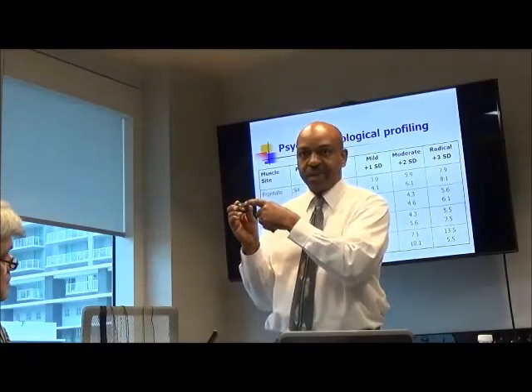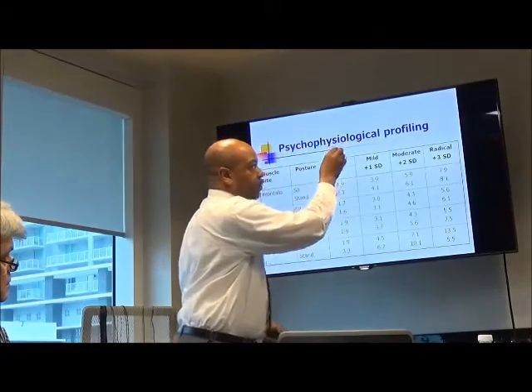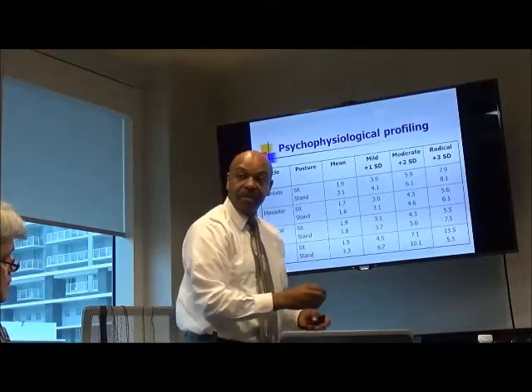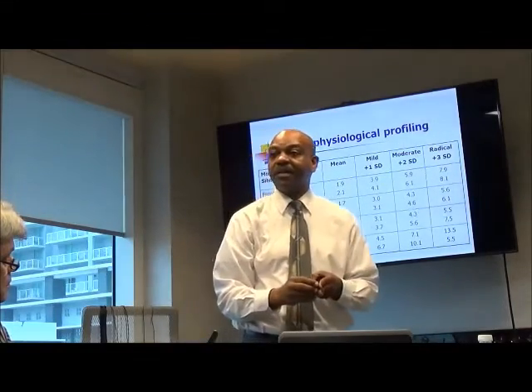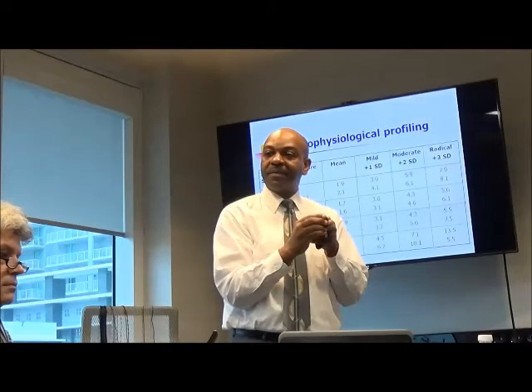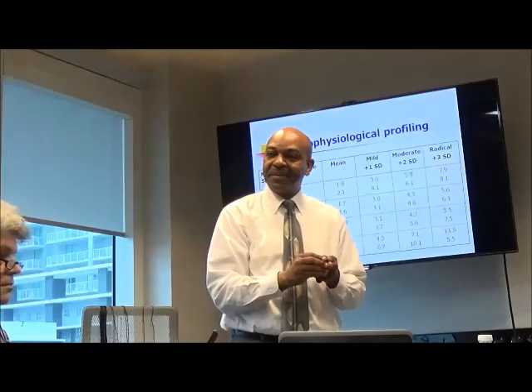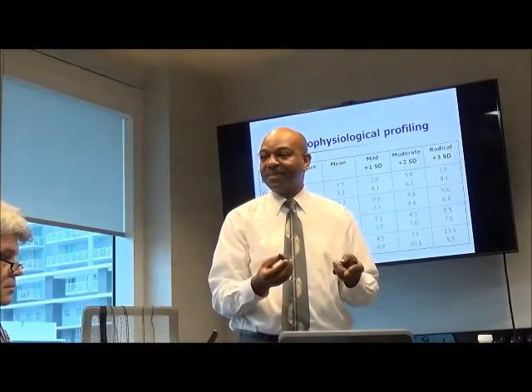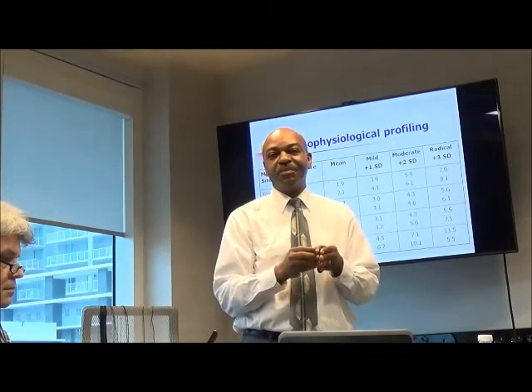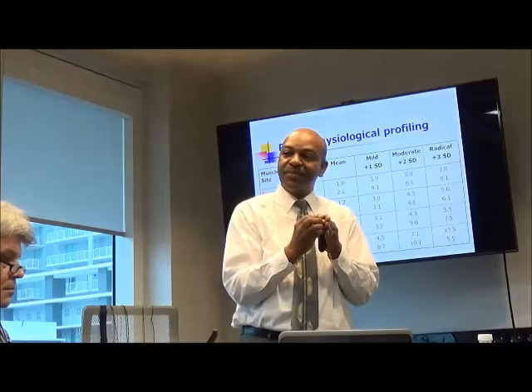This just has the connectors, but if it has the sensors on it, and now I'm going down the person's neck and back and touching different areas to measure the muscle activity there. But now, if I press lightly at one area, and then I press more strongly at another area, that's going to affect the reading. And so I may get a higher reading when I didn't press as strongly, just because the conductance is different.